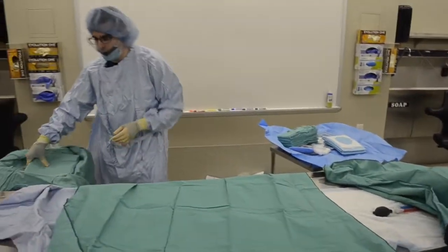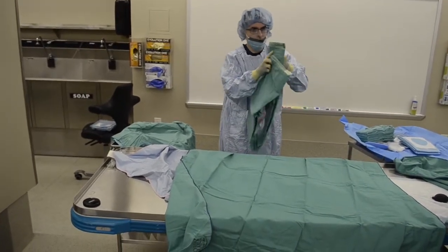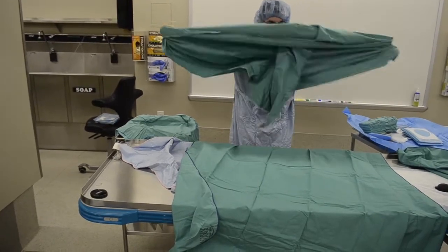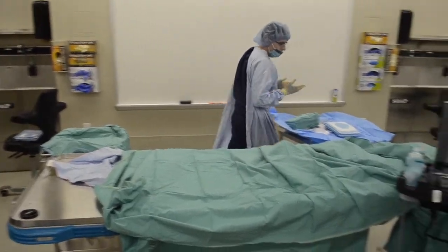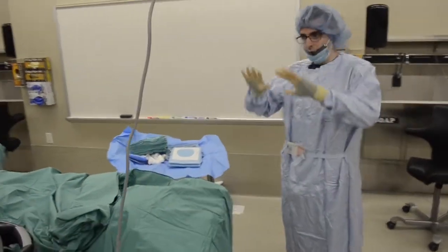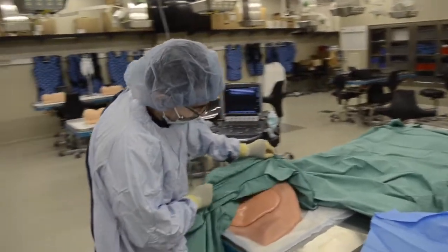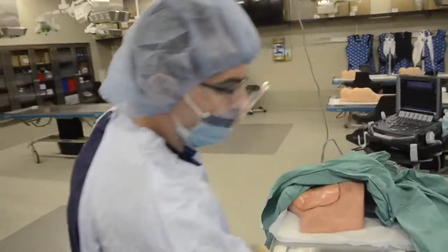The last one is a little bit more tricky. This is a long drape, and this can go over the patient's torso. Now we're ready to move in. Making sure our gown and our gloves don't touch any of our surroundings, we're going to go up to the site. So I'm going to re-expose that area on the neck. And then I'm going to use some towels for the local area.